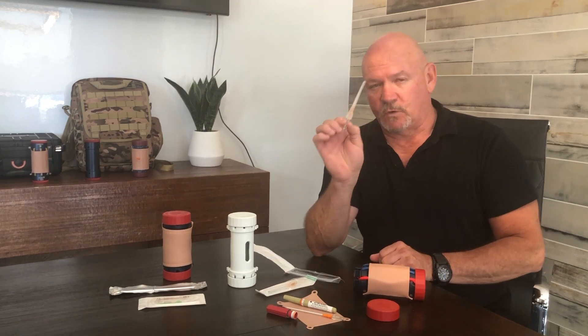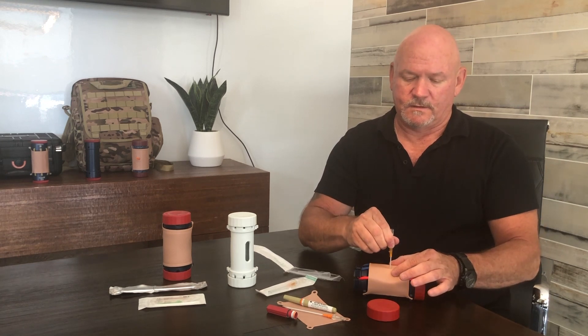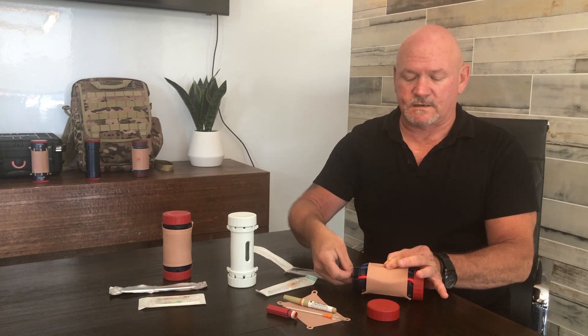Use a 14-gauge needle, which is your standard NDC needle. Remove the plastic safety covering and check the catheter for any burrs. Go 90 degrees straight down in between the second and third rib. As you push it all the way down, the sharps — the needle — goes inside so no one gets stuck, and then you tape it down. You've just successfully completed the needle decompression for tension pneumothorax on the IV trainer.